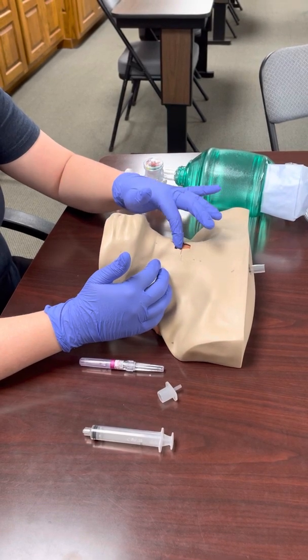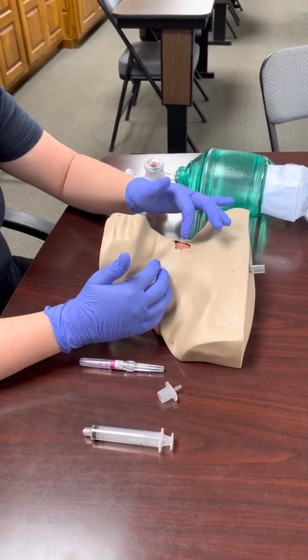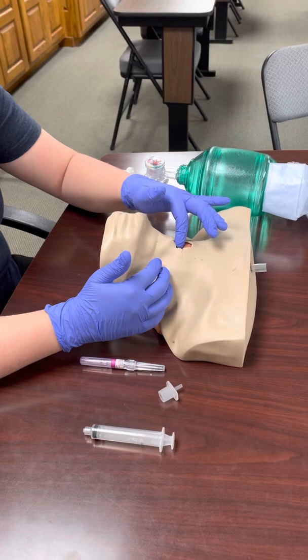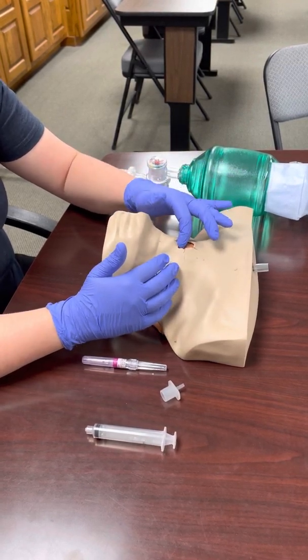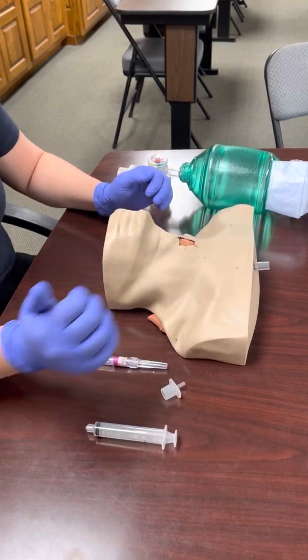There is still a pretty thick membrane so it is a little hard to puncture through, but we're just looking for that little divot. Obviously on this mannequin it's been used quite a few times for criking so the landmark is easy to find on him.